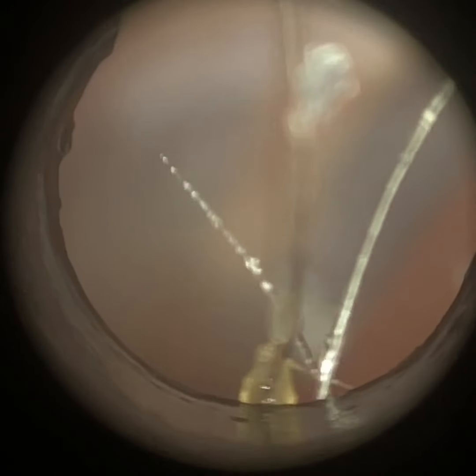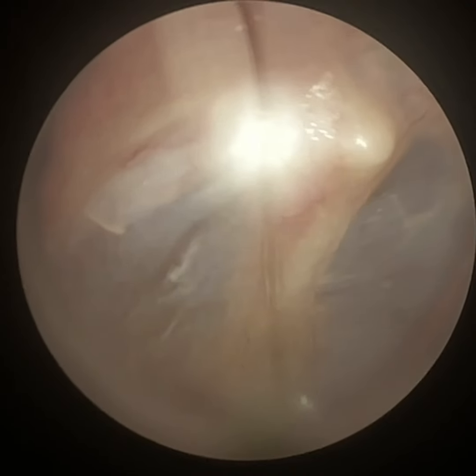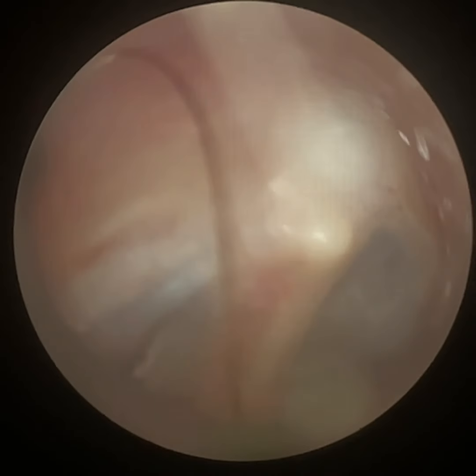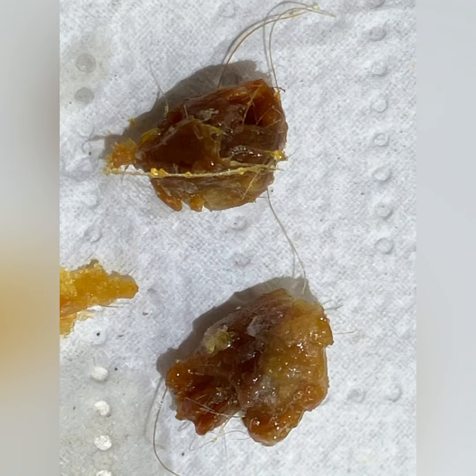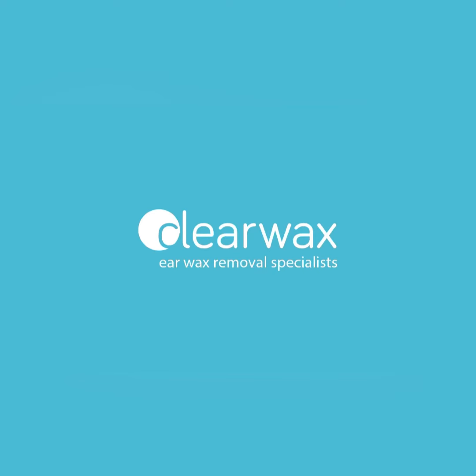I'm just going to re-enter. It's got a few long whiskers of hairs there. And that's the patient's eardrum. I hope you enjoyed that video. You can see under still images there are whiskers of hairs that are attached to the wax plug. Take care, keep well and speak soon. Bye.